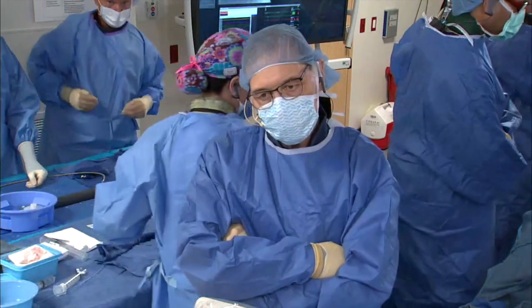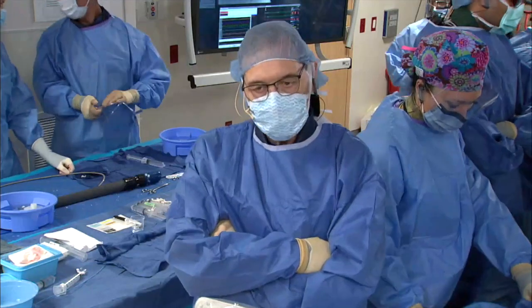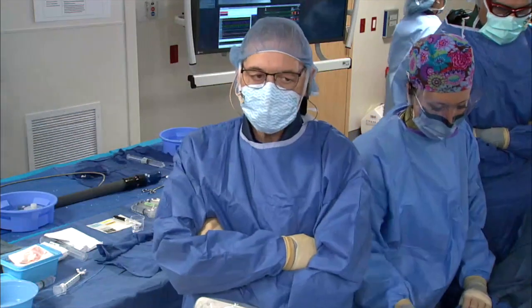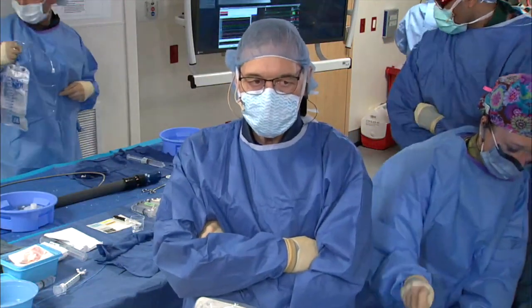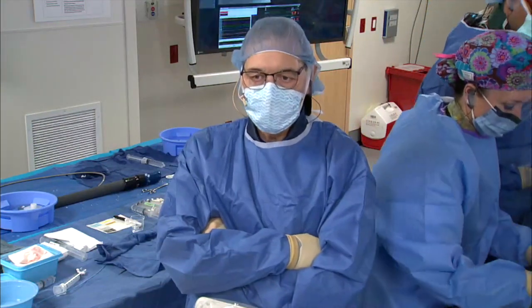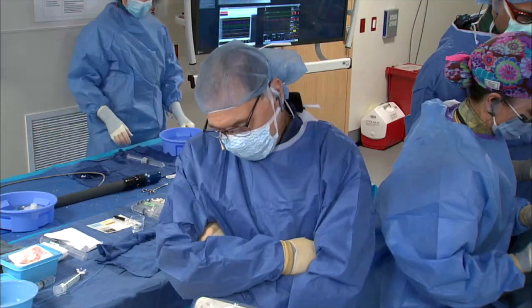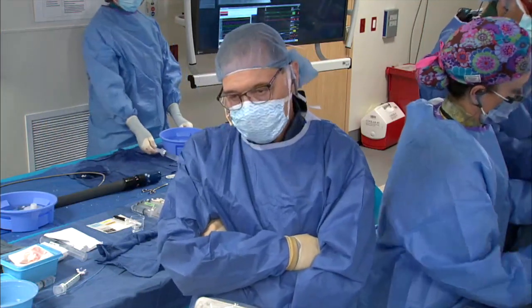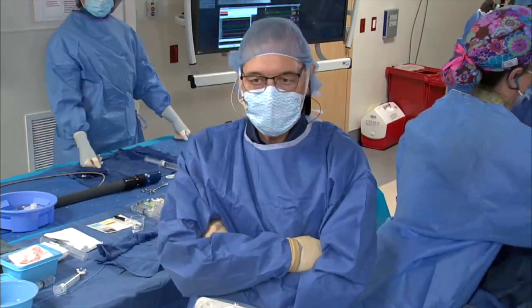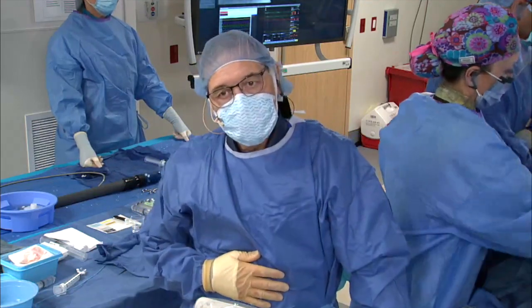To be fair, I think there are some potential downsides, and I'm sure they'll improve over time. The 20 French sheath is still kind of a problem. We have these borderline small vessels, and we use the Evolut R often rather than the Pro, because that's the smallest profile sheath for transfemoral access. And then there's a concern about interaction with the coronaries, especially as we start doing younger patients. Ten years from now, somebody needs to go in and do an LAD stent. Then how does that valve fit? So I think those are all things that have to come into play.